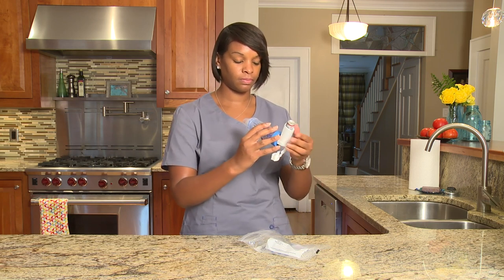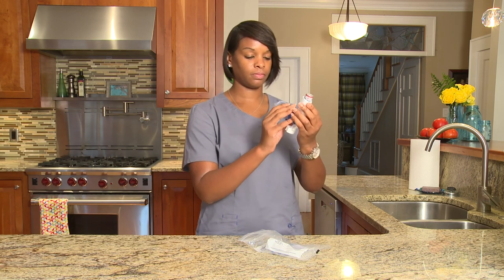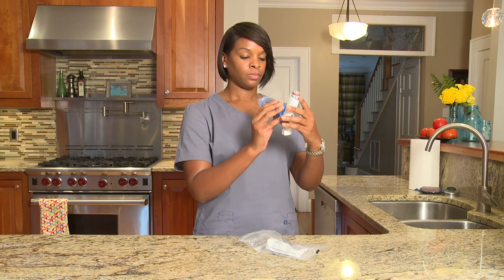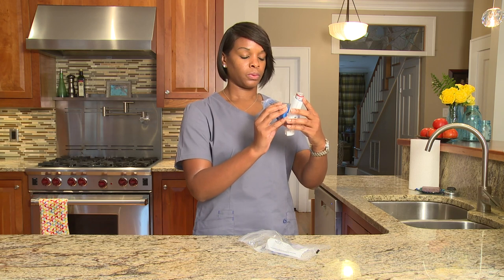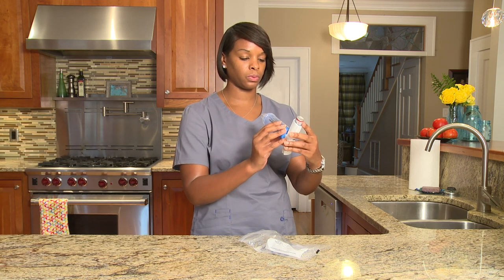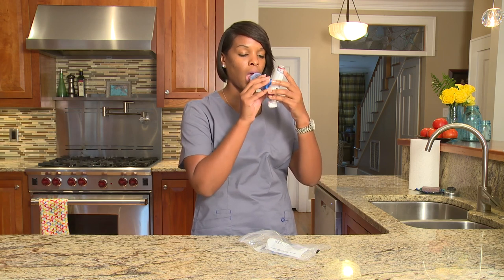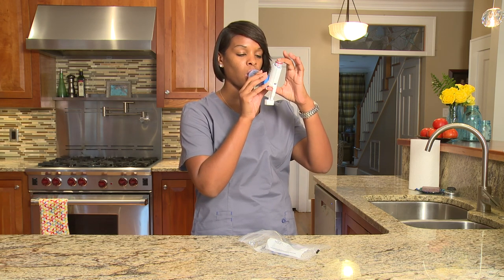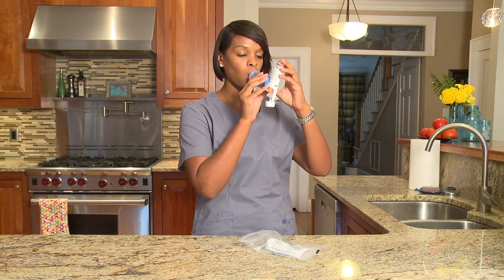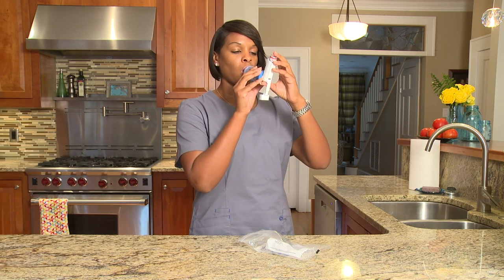Hold the MDI and spacer up with the mouthpiece facing you. When you're ready to take your medicine, sit up and blow all the air out of your lungs slowly. Next, place the spacer mouthpiece in your mouth and seal it with your lips. Press down on the MDI by squeezing the top and bottom of the canister and boot. This allows your medicine to go into the spacer.